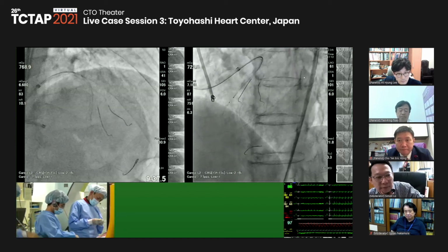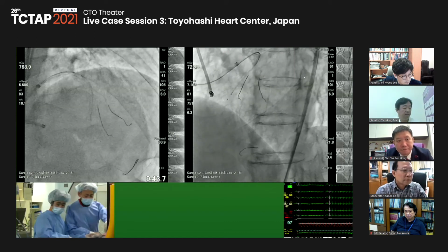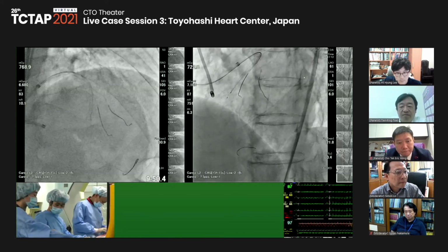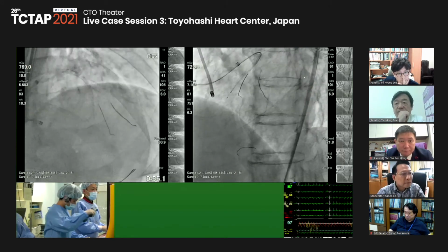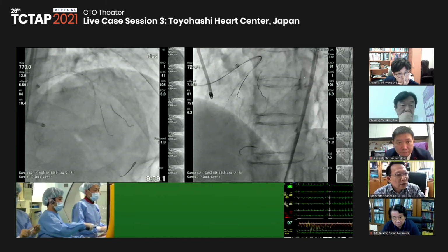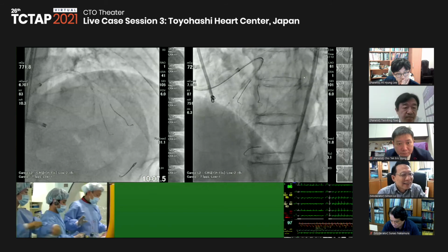So what's the next plan now, Dr. Nasu? This is a 3.0 NC balloon.